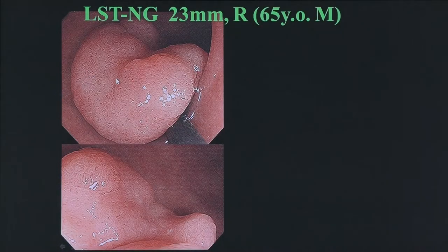This lesion, 23 millimeters in diameter, looked slightly depressed at the center.